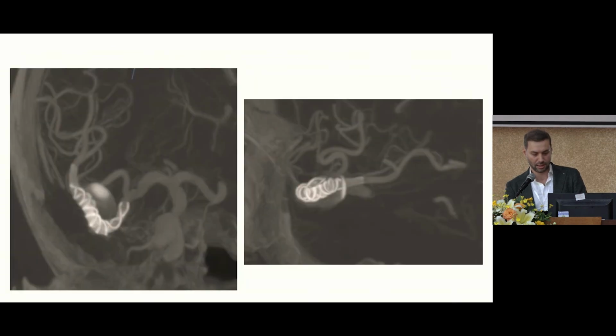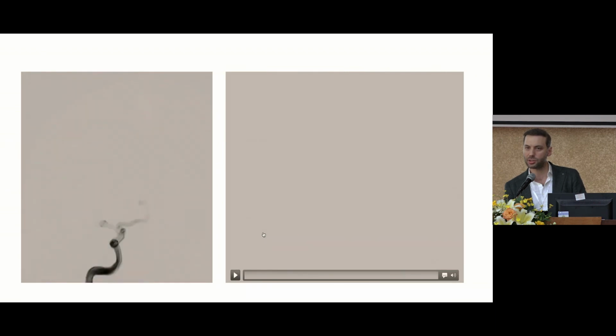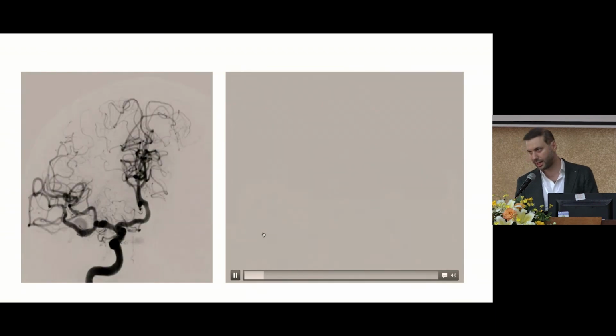Just after the procedure, AP and lateral shows very nice stagnation at the aneurysm. And I want to share the 6-month result of the patient with a nice reconstruction without any filling at the aneurysm.